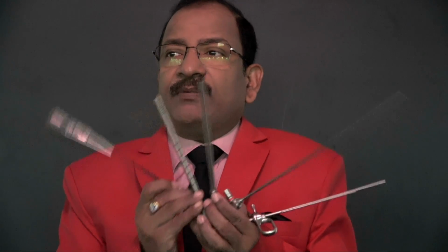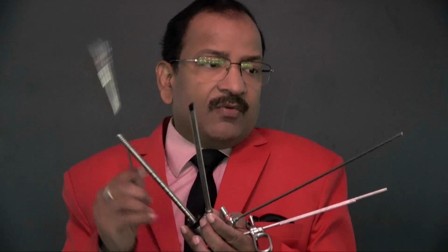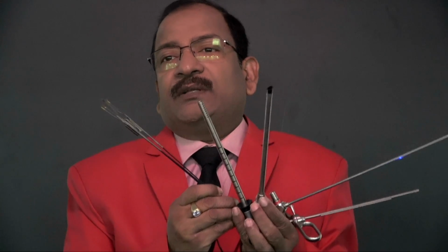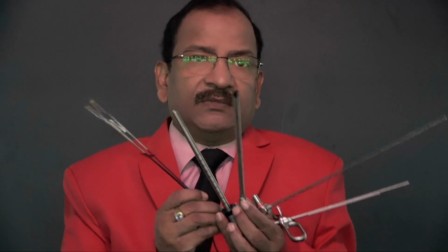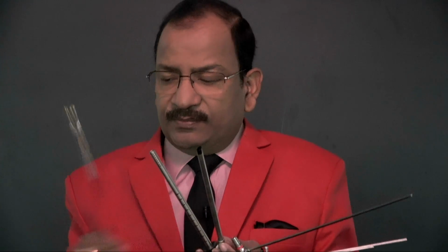These are the 5 components of the resectoscope: working element, telescope, inner sheath, outer sheath and electrode. These 5 components are assembled together to make the resectoscope. So let us assemble now.